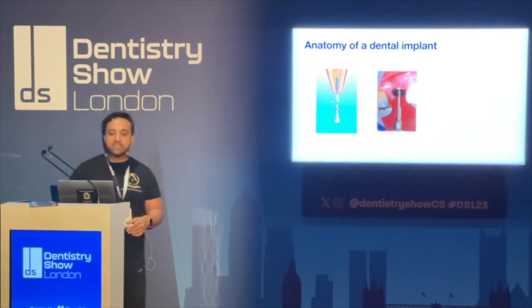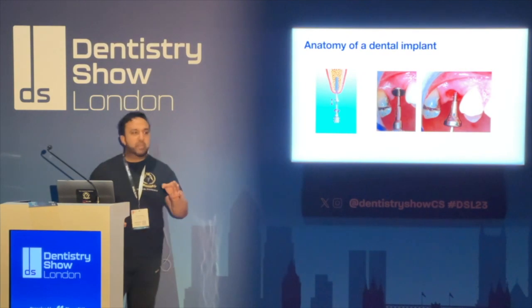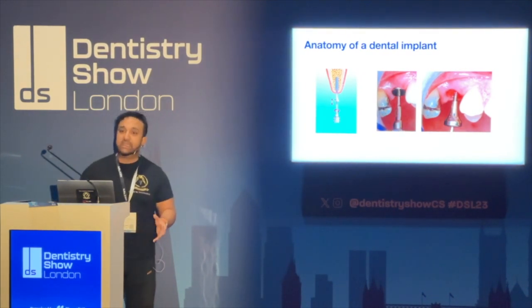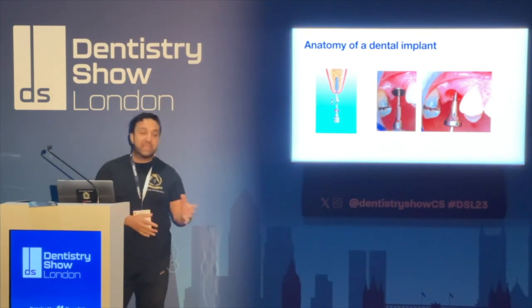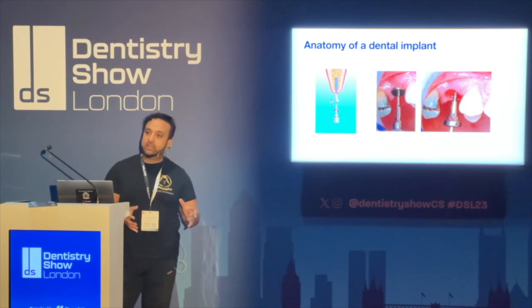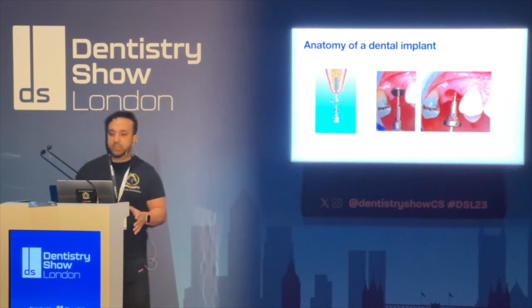Sometimes you might see a patient who has something unusual on their gum, which looks like a button that's flush with it. We call this a healing abutment, or a healing cap. When we place the implant, the osseointegration process, where the bone cells actually fuse with the titanium of the implant, takes 4 months to occur.